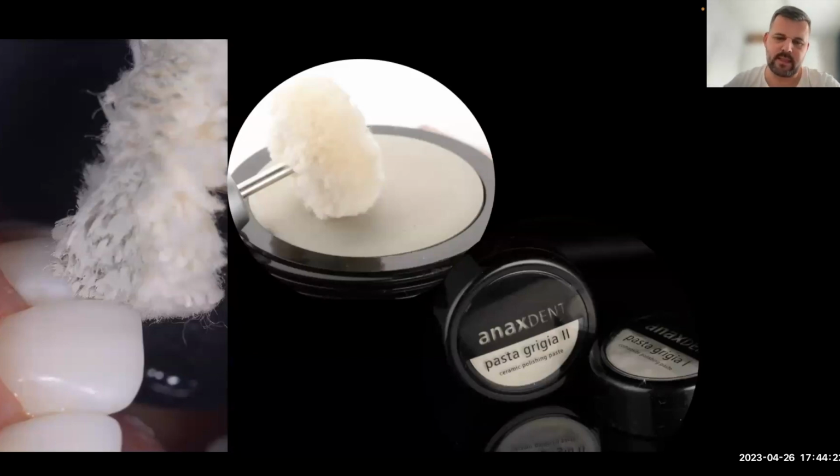now it's time to use this aluminum oxide paste with the cotton brush. And we also use maximum speed 10,000 RPM. And we want to polish this using this paste, but remember, the surface needs to be clean. Remove everything using the alcohol and prepare the surface for this paste.